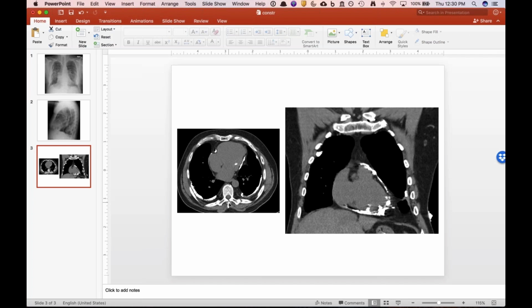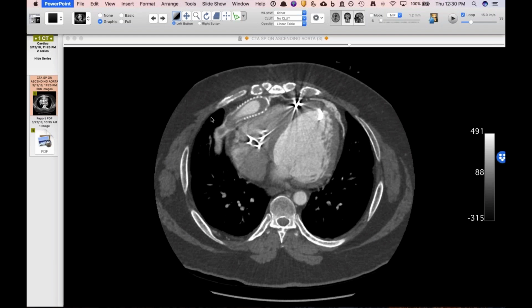Oh, that's interesting. Is that true? You're right. I mean, thinking about it, you do see sparing of the apex. Is that because of the motion of the apex compared to other areas? That's the rationalization, that it's the motion that's doing that. That's interesting. I never thought of that. I think we can conclude nobody else has ever seen a case of asbestos-related pericardial disease. So I'm challenging my own assumption on this case now. It's probably unrelated. But that's helpful.